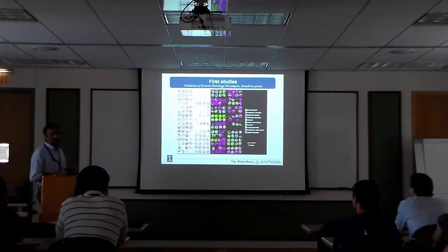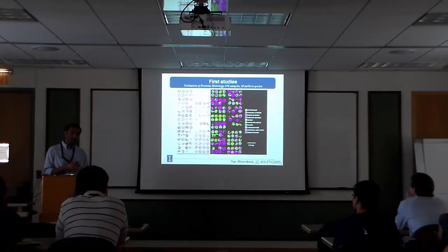So when you read literature like this and you look at people claiming to do spectroscopy of this and diagnosing that and so on, I think a few things need to be looked at. What is the variability of the sample set that they were getting? Was it from one setting? There's a certain claim you can make from one setting. You can say, look, there's perhaps potential in this. You can't say you have a diagnostic test, right?